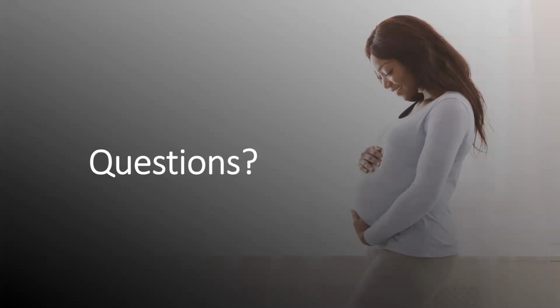What happens then? Yeah, I agree. That's a great question, and definitely a question we get, or I get a bunch. So I think there's a couple of things to consider. One is what I presented, that some of those non-reactive NSTs or an isolated deceleration that you feel the need to act on when they're in front of you. But I think that the ability to monitor remotely allows me to be more patient, because I don't have to worry about the pressure of getting a patient off the monitor or getting the next patient on the monitor, having my staff take a patient off. I can be more patient, giving more time to get the patient to be reactive and more time to get reassurance after an isolated deceleration without having to send the patient to the hospital.